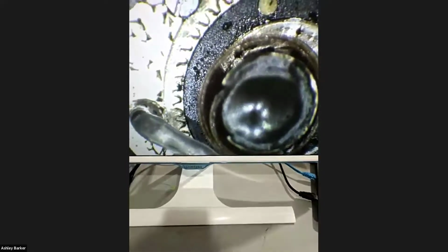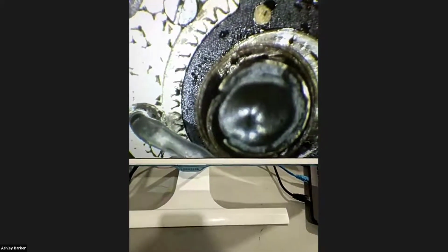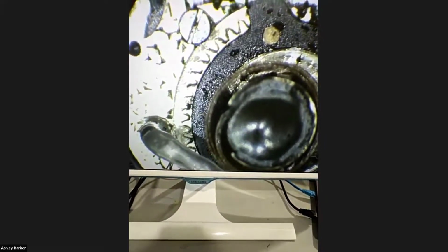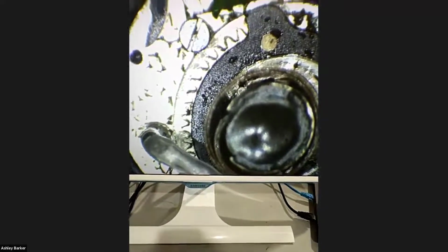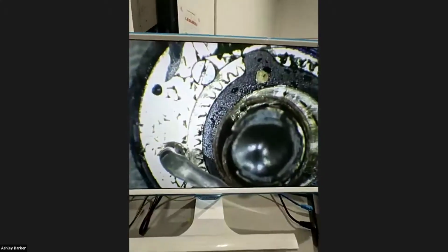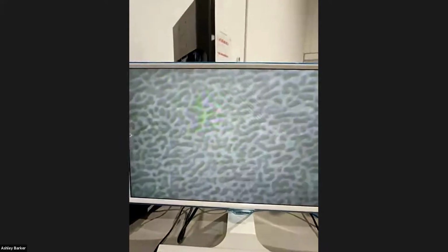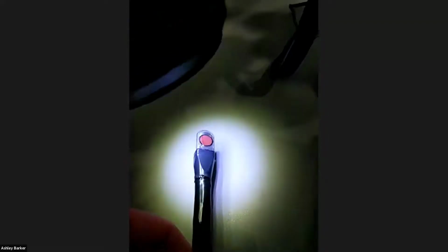It's very much like a Swiss watch in the back. There's lots of little gears and tiny limit switches, and it's quite good technology. Let me explain what you're looking at there. So let me flip that round. There is the front. It's a bit out of focus, but that's the front face of the probe. That red bit is the array.